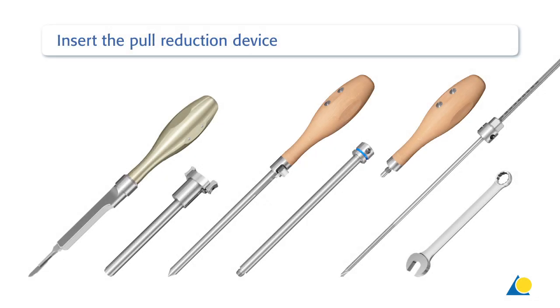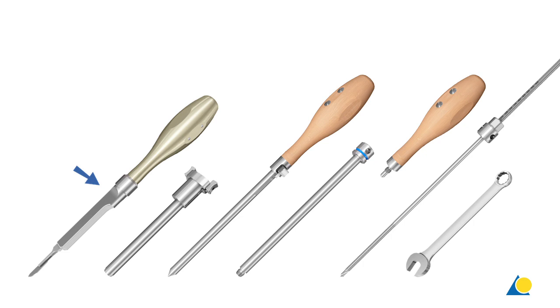The instruments needed to insert the pull reduction device are the scalpel handle with a scalpel, the guide sleeve, the trocar with handle, the 4.3 mm drill guide, the handle, the pull reduction device, and the 11 mm combination wrench.